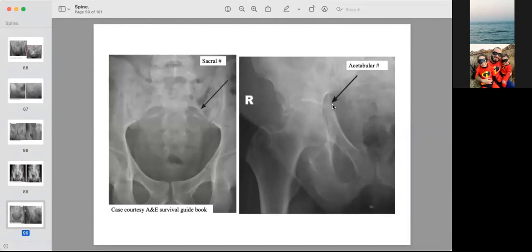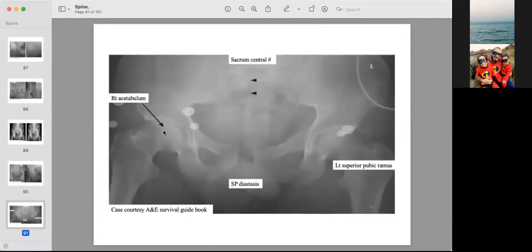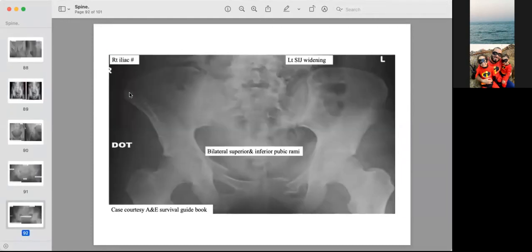Multiple pelvic injuries can coexist — don't be satisfied with finding only one fracture. Examples include diastasis of the symphysis pubis, sacral fractures, acetabular fractures, widening of the sacroiliac joint, and superior and inferior pubic rami fractures bilaterally. Always check the entire pelvis systematically.